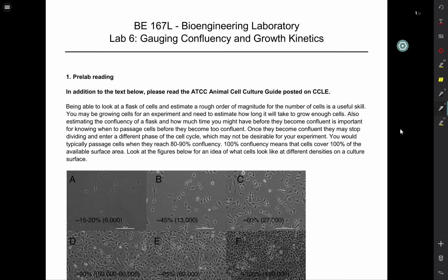Hi everyone, in this video I'll be going over Lab 6, Gauging Confluency and Growth Kinetics. In this lab, you will be assessing the confluency of cells that you seeded previously and getting more practice passaging cells. Please also take some time to read the posted reading, as it may seem like a lot, but there's a lot of good information.